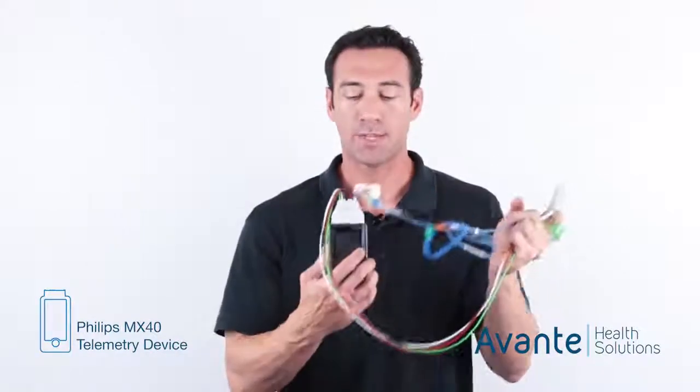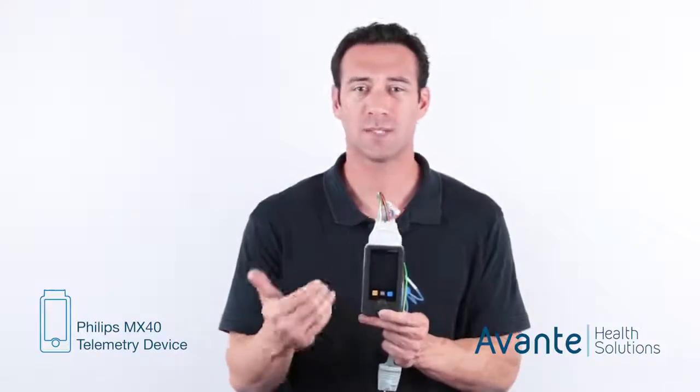Okay, again, these are going to be worn after some kind of an event or after surgery. They want to see how the patient becomes mobile and make sure that they're able to get up and move around before they're released from the hospital. So telemetry, that's mostly how it's going to be used for looking at the patient's heart, specifically the ECG.